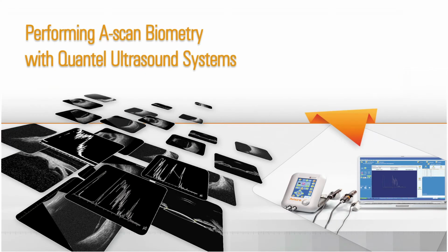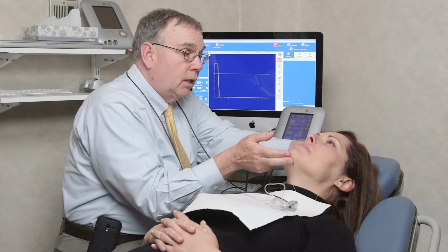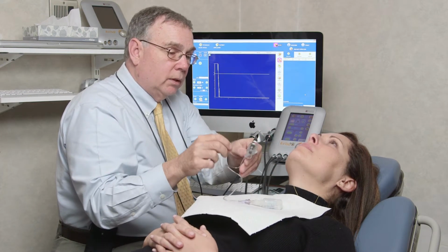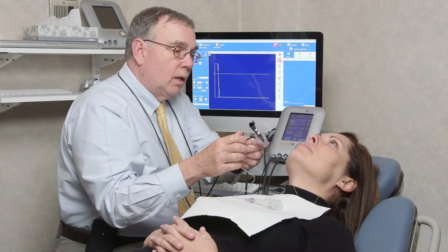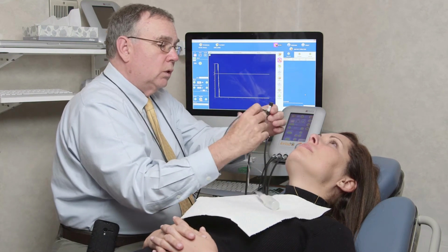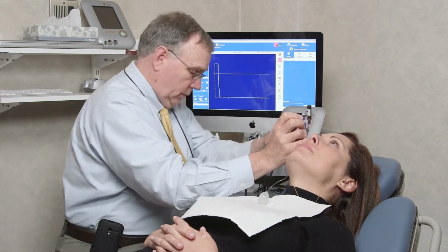Performing A-scan biometry with Quantel ultrasound systems. In this brief video, we'll review the fundamentals of performing A-scan biometry with ultrasound equipment from Quantel Medical. We'll cover the basic physics of ultrasound, equipment features, and the process of obtaining a reliable reading.